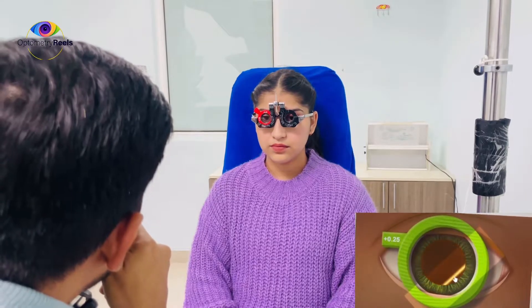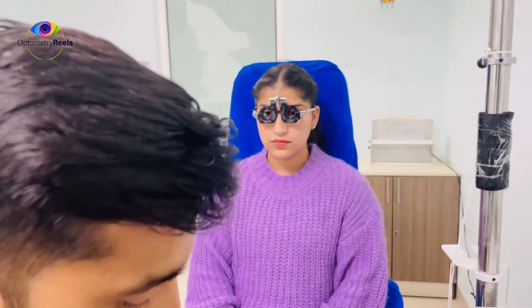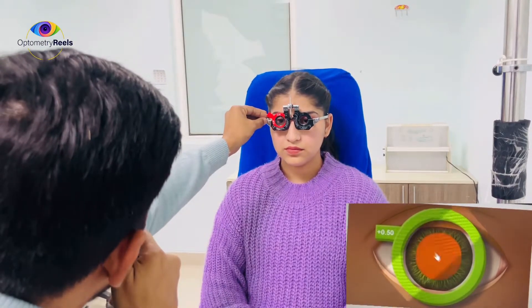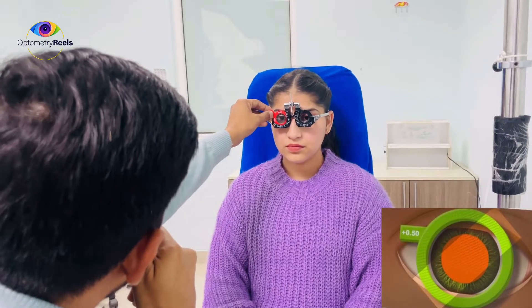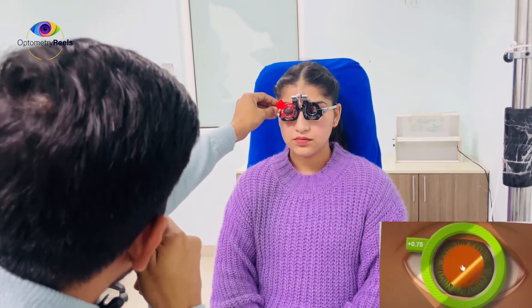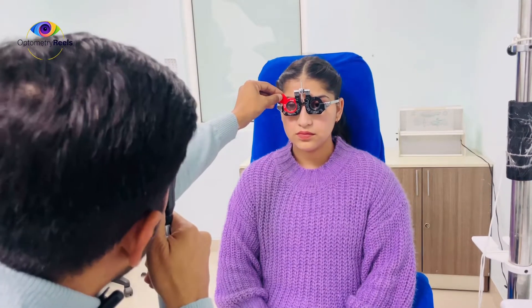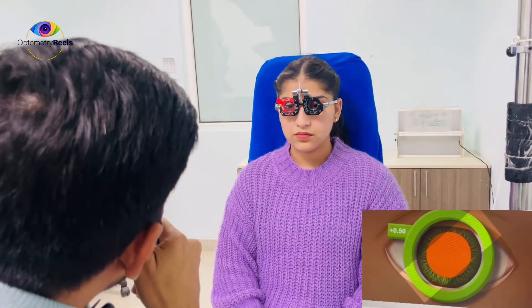Still I can see with movement, so I am going to increase this lens. Now I can see a neutral glow — it has neutralized. But I am going to confirm this by putting some more power. I am going to put 0.75. Now I can see against movement. And if I put this in the concave mirror, I can see it's with movement. So I think 0.5 is the neutral point for this meridian.